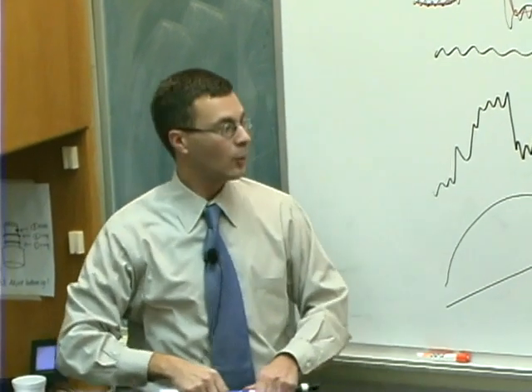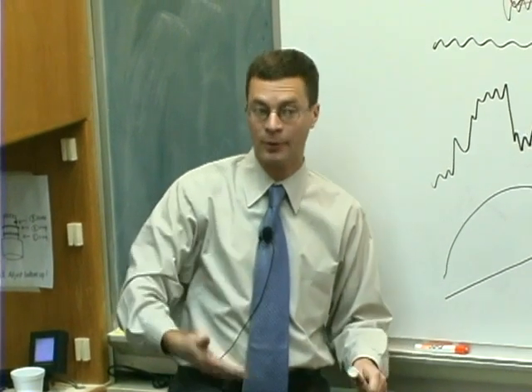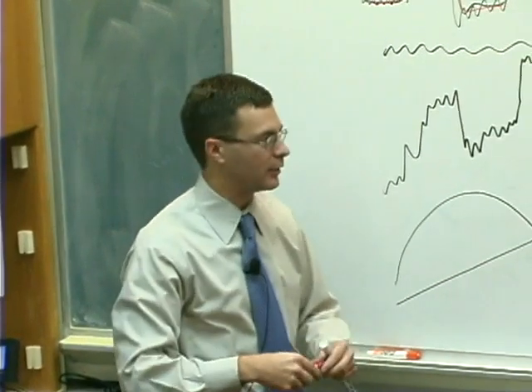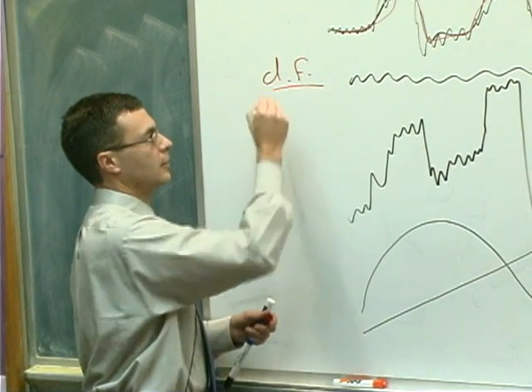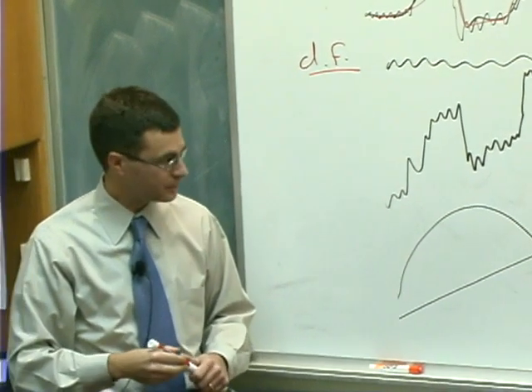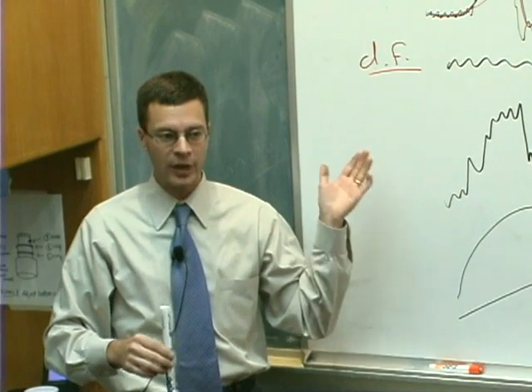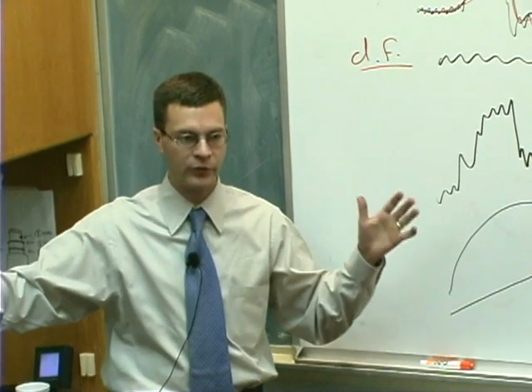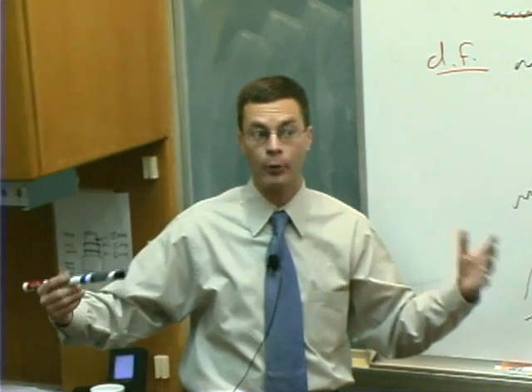So what to do? Well, it turns out that the statistical model we use is capable of taking into account the fact that you've done this smoothing. And the way that it does this, in effect, is by adjustment of something called the degrees of freedom. For those of you who aren't familiar with the term from statistics, you earn 1 degree of freedom for each observation that you make in your data. So if you have a scan which has 1,000 TRs in it, you take 1,000 pictures of the brain, you've earned about 1,000 degrees of freedom.